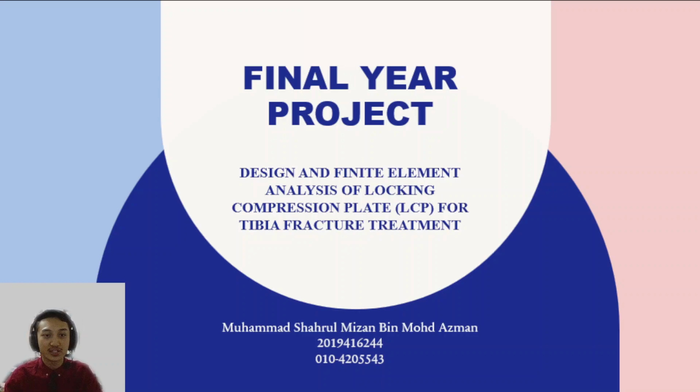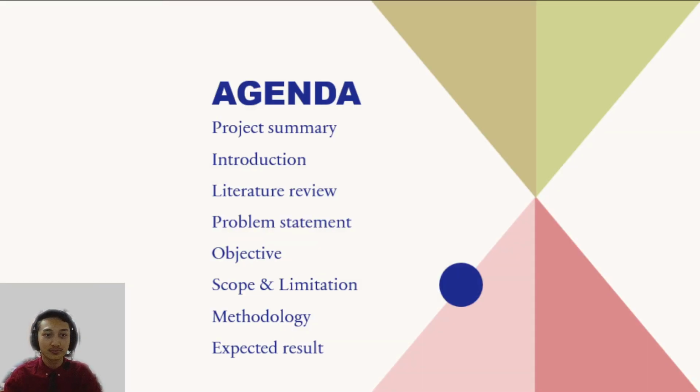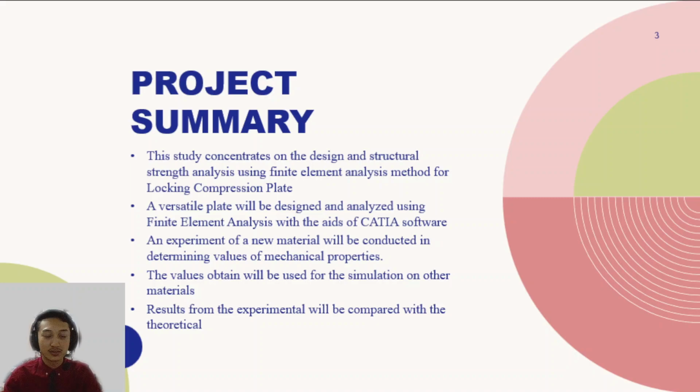My final year project title is Design and Finite Element Analysis of Locking Compression Plate for Tibia Fracture Treatment. In this project, bone fracture is the most common orthopedic problem. Osteosynthesis surgery is used for internal fixation of bone fragments. In order to achieve stability of fixation, compression plates are the solution to regain and heal through biological internal fixation. Locking compression plate, also known as LCP, is widely used in the medical field for internal fixation.